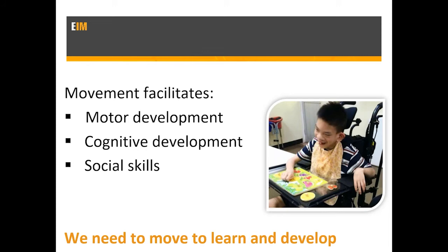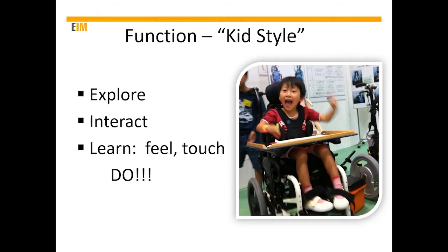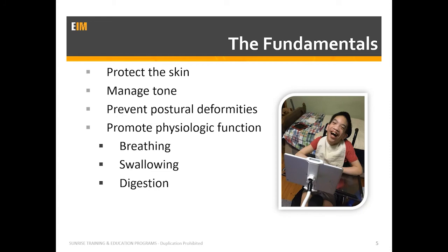We've known for decades that in order to grow and develop, we really need to have facilitated movement, mobility in general. It's very, very important. And we also know that kids learn by doing, by playing, by touching, by feeling. So we need to allow them to investigate their world and participate, whether that be at a manual wheelchair level, a little scoot level, a power wheelchair, or power assist. We need to facilitate that independent choice, that mobility, underlining our need to create those developmental milestones, to reach them, to facilitate inclusion.